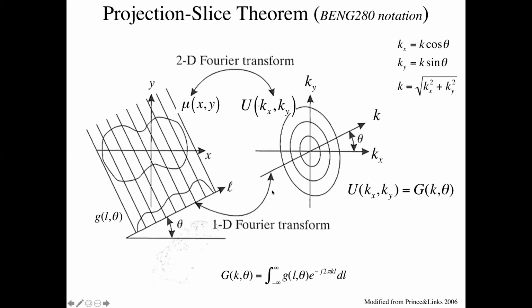And when you write it down, this is what it says in just algebra: when you take the 1D Fourier transform, which is this operation here, where we're integrating over DL in this direction with the standard Fourier transform, it gives us this sample here through the middle.